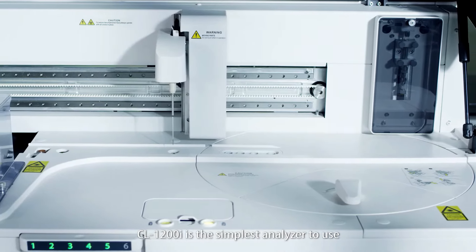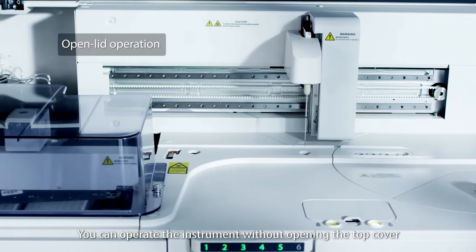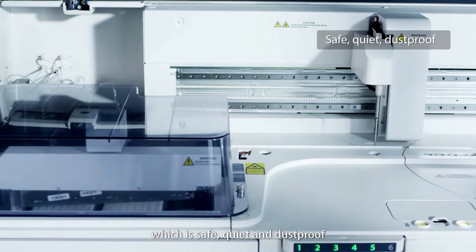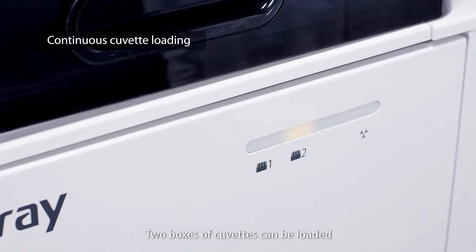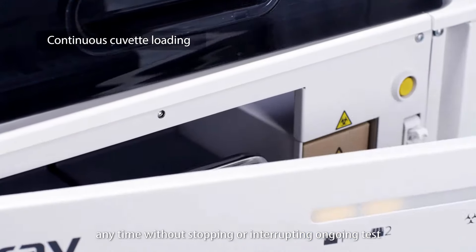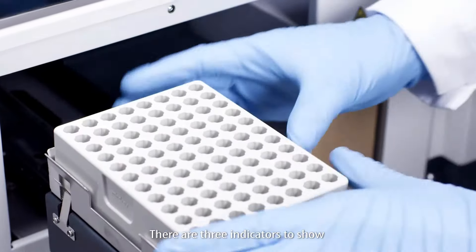CL-1200i is the simplest analyzer to use. You can operate the instrument without opening the top cover, which is safe, quiet, and dustproof. Two boxes of cuvettes can be loaded anytime without stopping or interrupting ongoing tests. There are three indicators to show the real-time status of the cuvettes and waste bag.